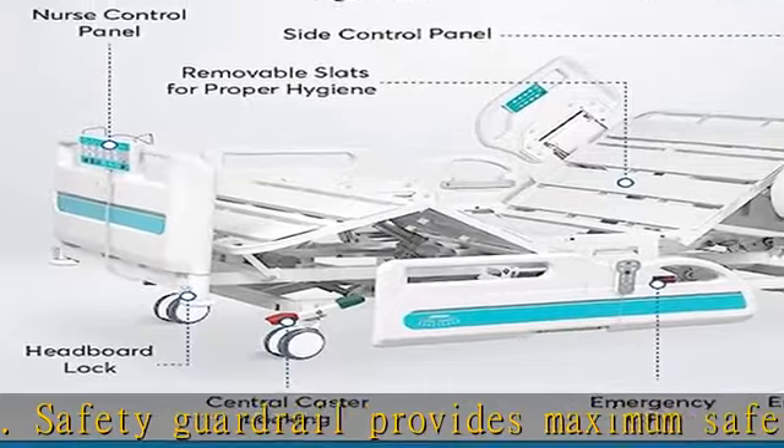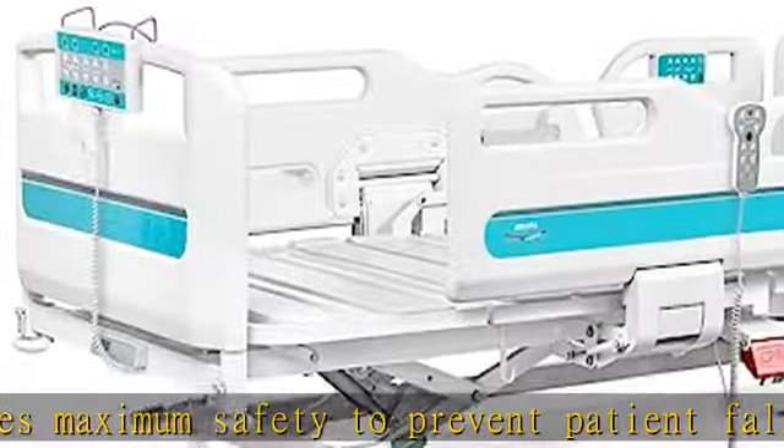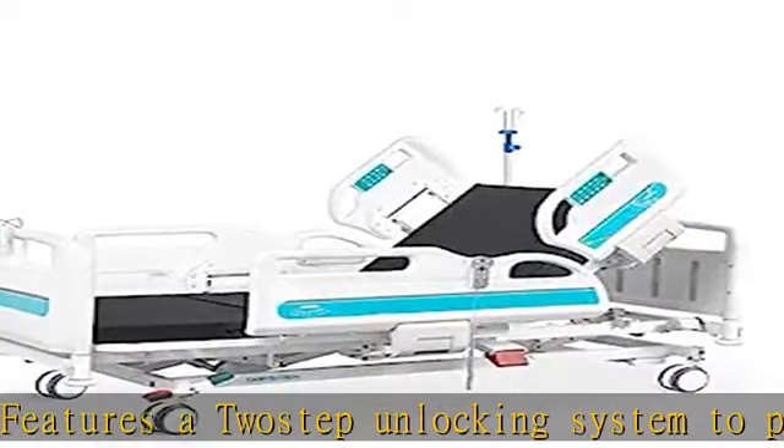Four-pole adjustable height IV stand with four hooks included. Angle indicator from 0 to 90 degrees shows the angle of the backrest and Trendelenburg position. Drainage hooks for four urinary drainage bags. Night light under the bed.